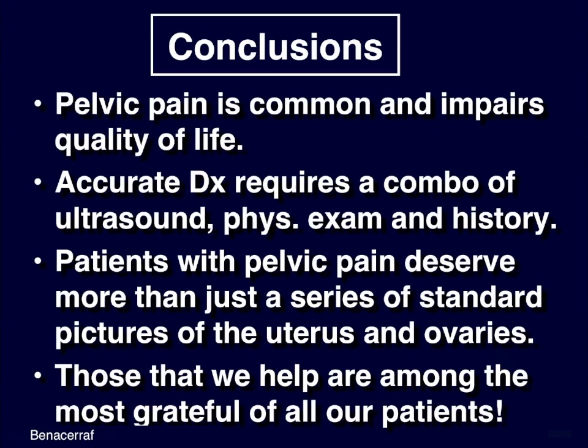So in conclusion, pelvic pain is common, and it impairs the quality of life. It is really important to find the lesions that are causing this. An accurate diagnosis requires a combination of ultrasound, physical exam, and history all at the same time. And that's why ultrasound is so great at dealing with pelvic pain, because you can do imaging and physical exam and history all at the same time.